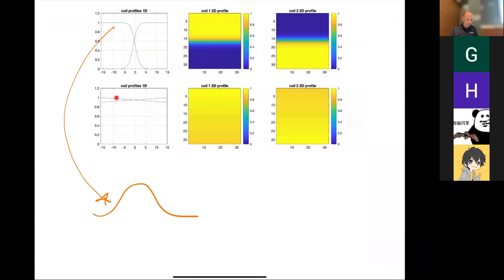Now think about this. This coil sensitivity pattern is much broader, right? So what is its Fourier transform going to look like? It's going to be much narrower. So it's going to do much less blurring, and neighboring points aren't going to be as related to each other. So whether you do GRAPPA or SENSE, you end up with the fact that the coils need to see something different, which makes sense. Because if all the coils see exactly the same thing, then you can't really take advantage of the coil diversity to make up for your undersampling.